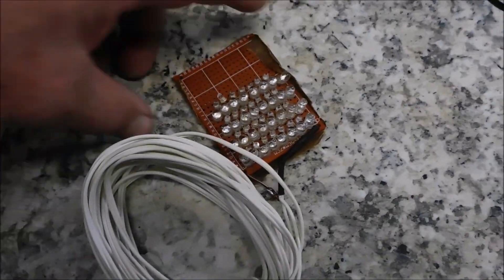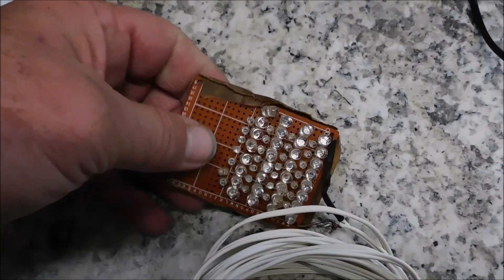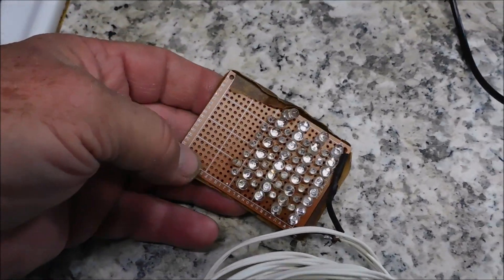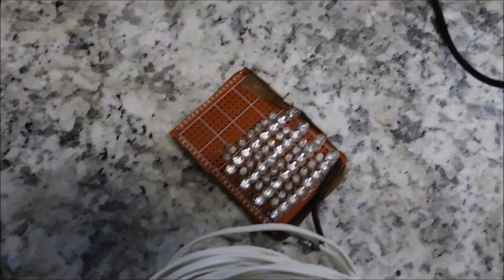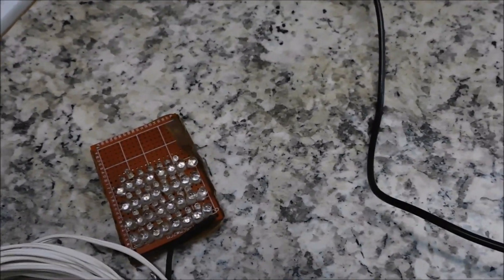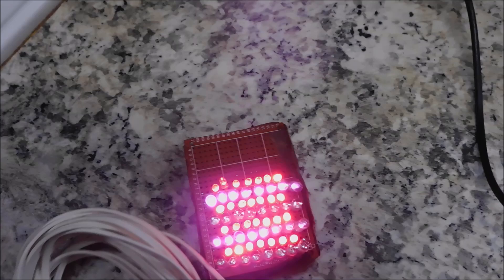It's time for a new red light therapy unit. Here is my original test to see if it would do anything at all, and I'm quite amazed at what it does, especially for pain.